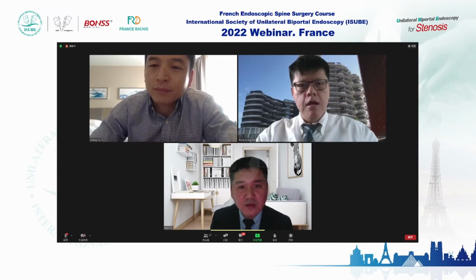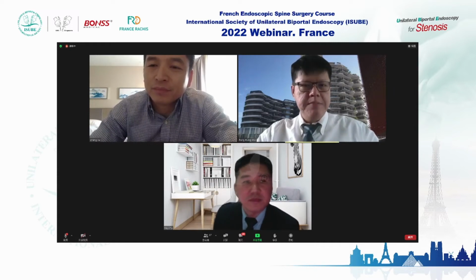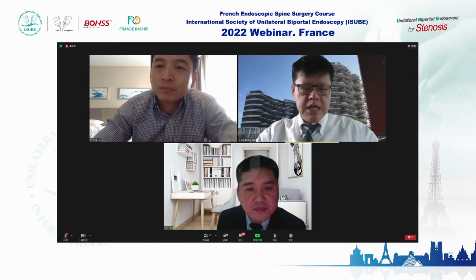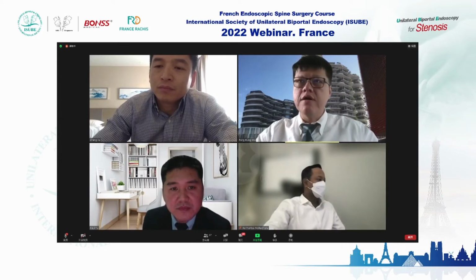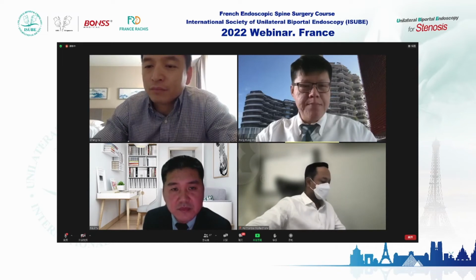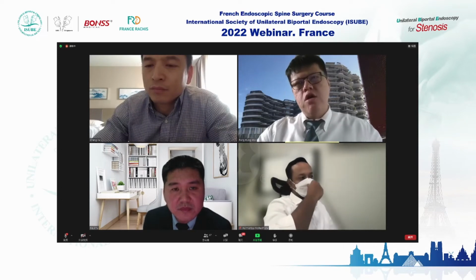What's your comment? Suggestion? I think in the early phase of our training, the dural tear can be more common, and incomplete decompression are the common causes of complication. Later part, because I personally do not use a drain, I have 2 cases of hematoma.